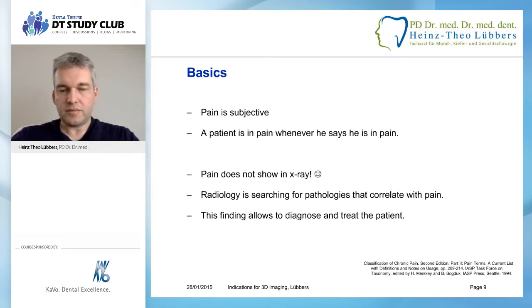And after then, of course, we can have a diagnosis, and then finally, after the diagnosis, we can treat the patient. That's the final goal. And this slide implies what we want to treat is not what we see on the X-ray. Of course, there is a correlation, or at least we hope that, but we don't treat the X-ray. That's an important point. We come to that later.